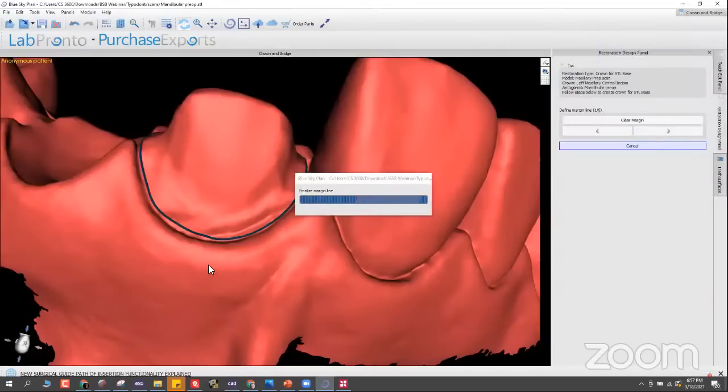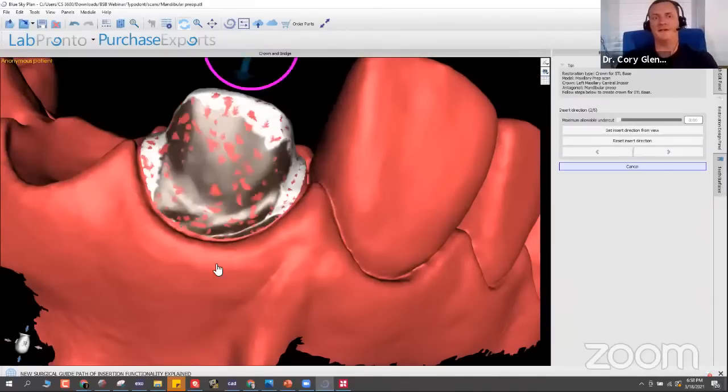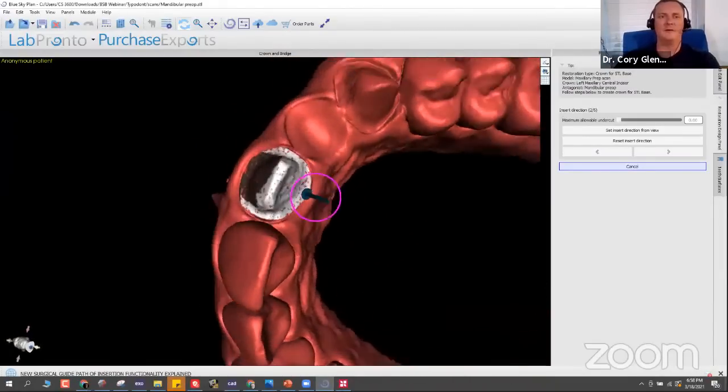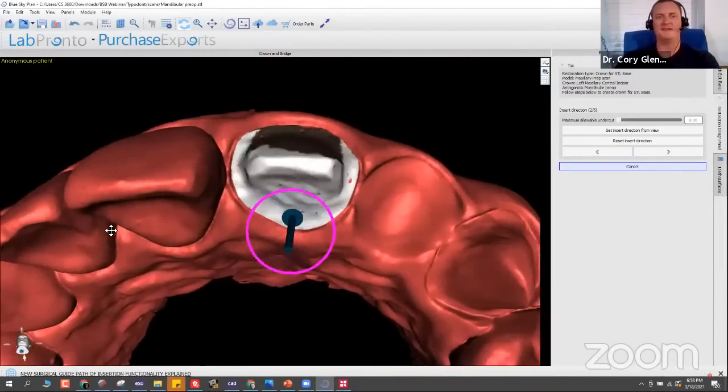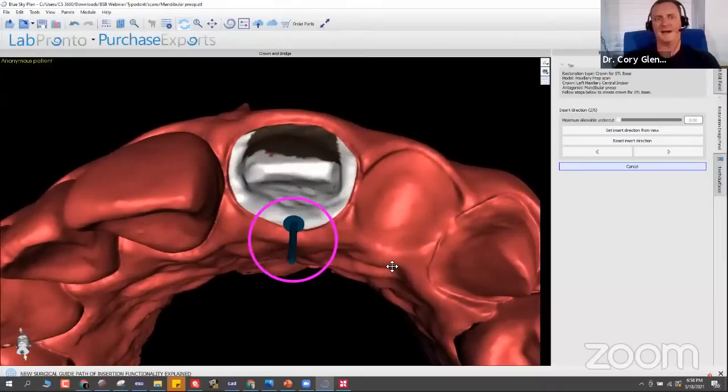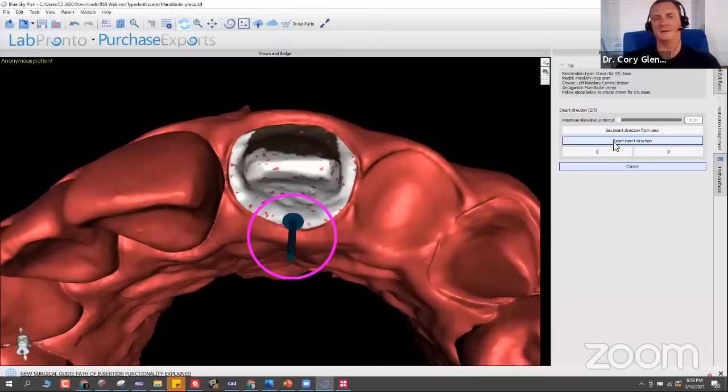Can you print multiple crowns at a time? Yeah, in fact, that's one of its huge advantages over milling. Think back to one of my early slides where I was doing those no prep veneers. You could print, let's say, 24 veneers or crowns all at once in one build, and it would be 23 minutes. With milling, it grows exponentially as you start doing more units because it has to physically remove material. So you could maybe mill them out of a disc and not ever have to stop and reconfigure, but it's still going to be a very slow process. Gosh, I bet you could fit 100-something crowns on a single run if you were using like the SprintRay Pro.